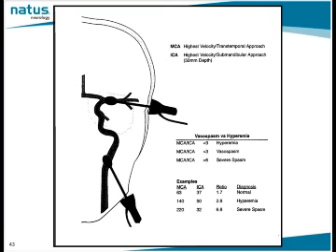Now, if we're raising the patient's blood pressure, then flow will go up in the brain, and it will also go up throughout the whole body globally. So what we're doing is we are comparing the extracranial ICA information to the MCA information.